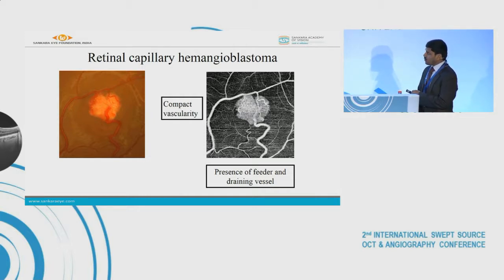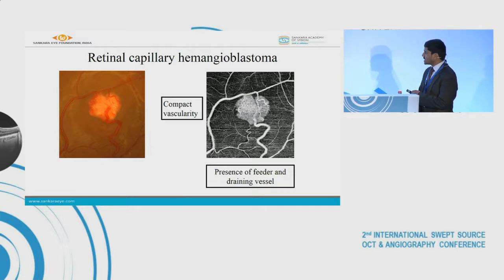It's a compact vascular signal indicating its vascular origin. We can also see the draining vessel and the feeder vessels and their branches.